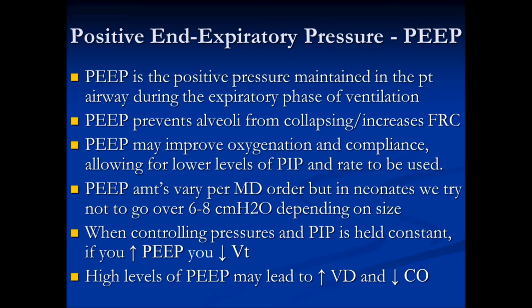It didn't have time to get down to the alveoli because you kept so much pressure in there from the previous breath, a lot of that ventilation that you just took in on that current breath didn't make it down to the alveoli.